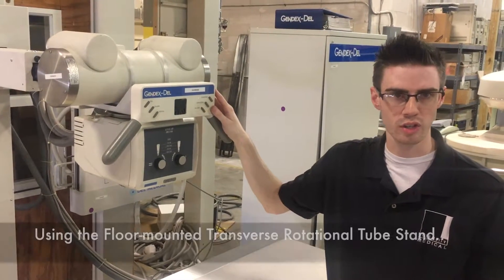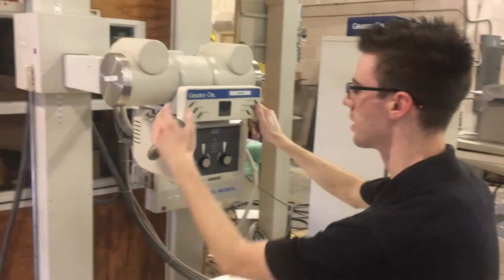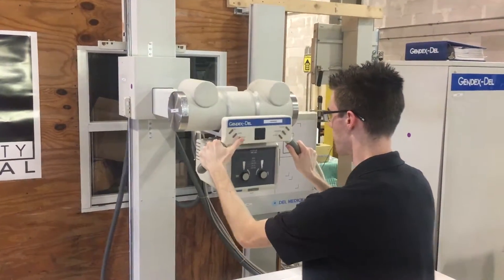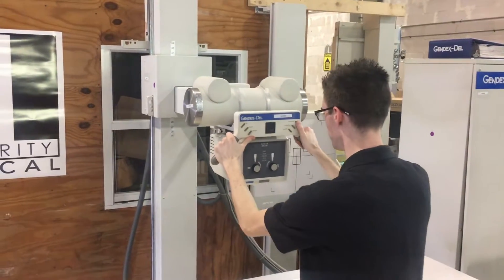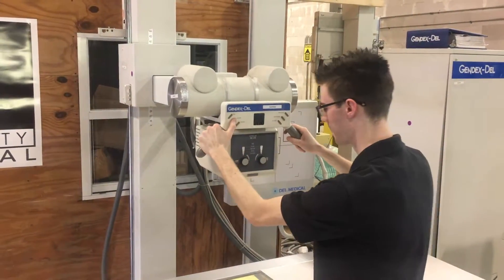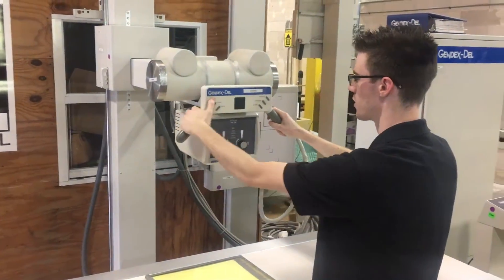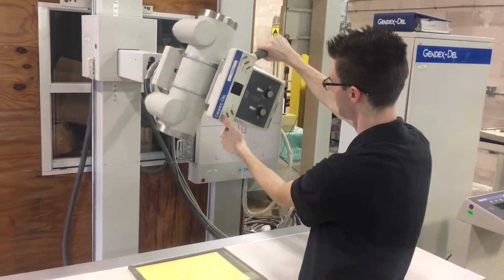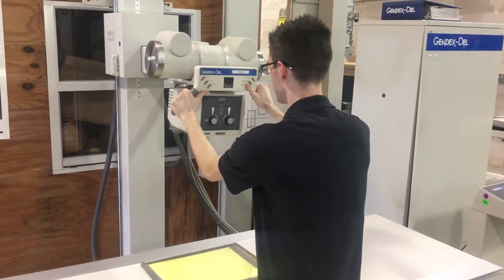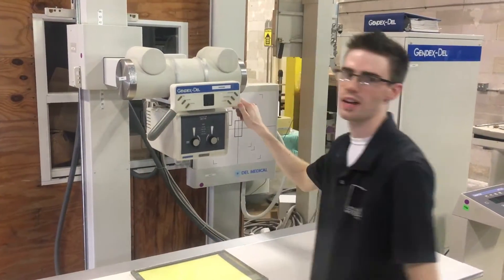This is a floor-mounted transverse rotational tube stand. By pressing the buttons on here you can control the movements of the tube stand. Here we have the vertical lock, the transverse lock. You can even control the column, you can even roll the tube. And this button right here will release all the locks. And that is how the tube stand works.